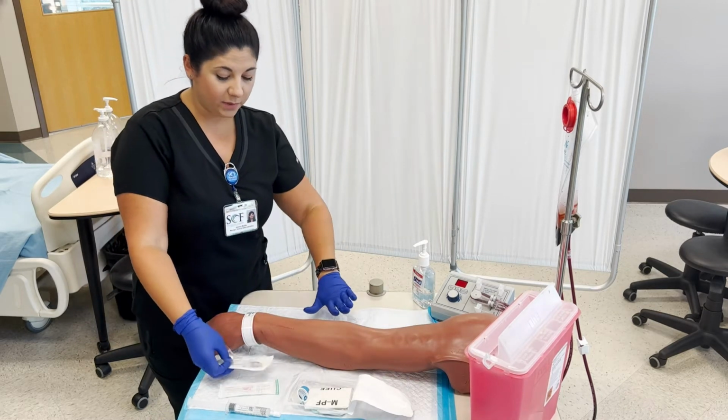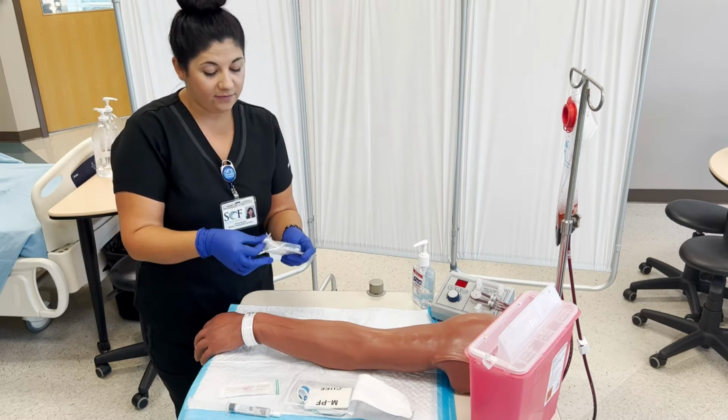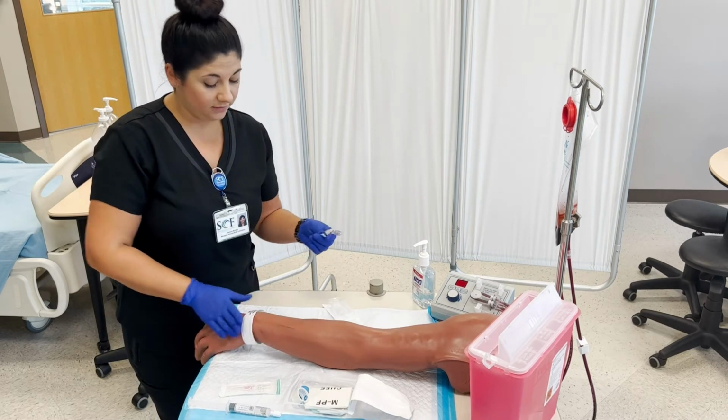I'm already looking at my patient's arm to decide what vein might be good to use. I've asked my patient if there's any reason I can't use a specific arm, and we're gonna go with his left arm here.